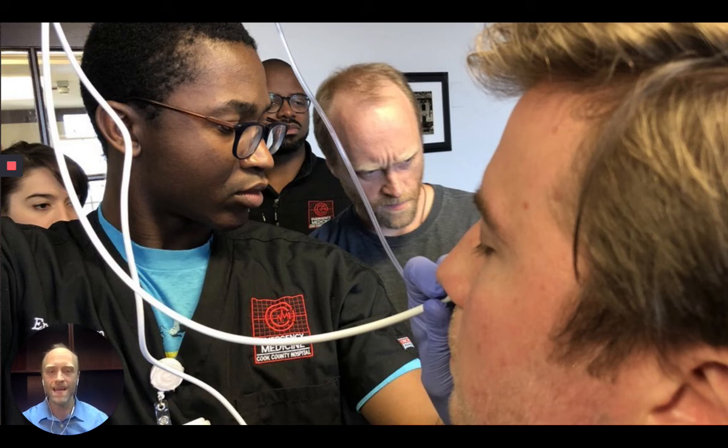The participants do not necessarily need to intubate each other, but doing the topicalization and driving the scope through the nasopharynx on a real person and having it done on them really builds their confidence, and it also helps them talk their patients through the procedure in the emergency department as they have experienced the procedure themselves.